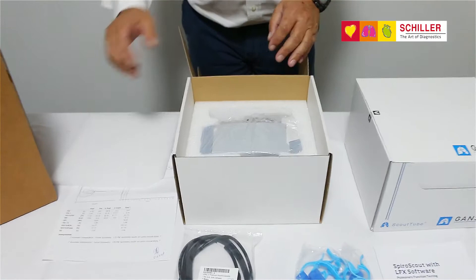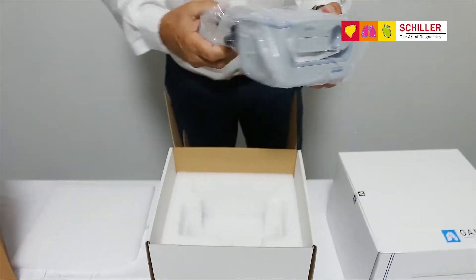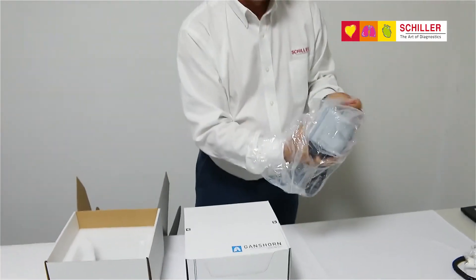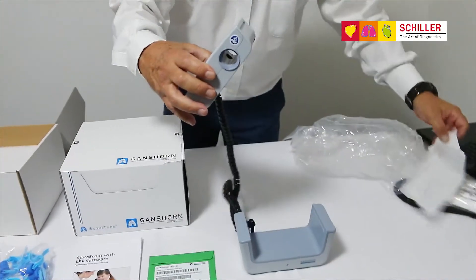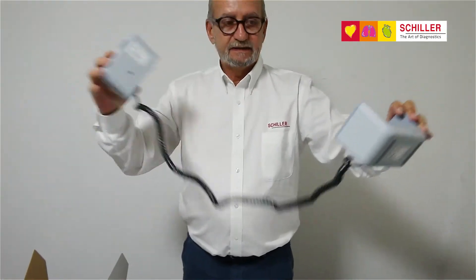Inside the box you will have the actual Spiroscout with its two parts, the handpiece and the base, connected by a cable.